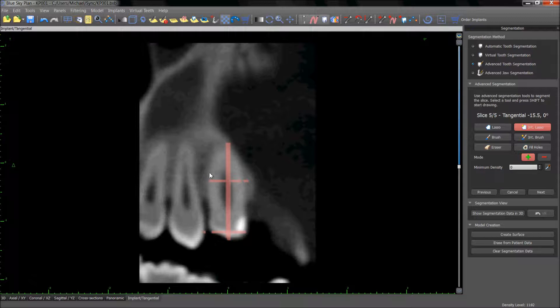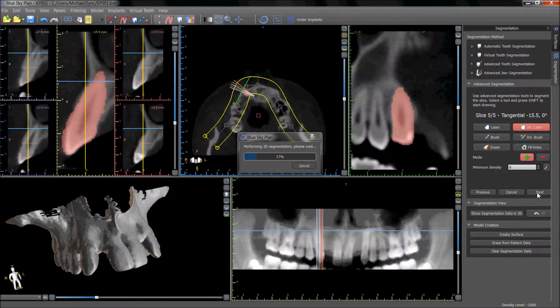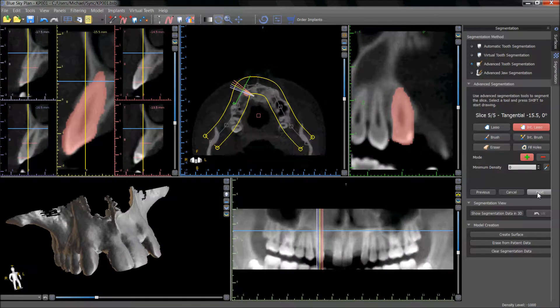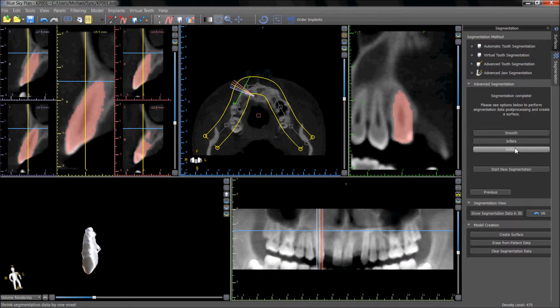The pink lines shown in the 2D views indicate the areas that have been indicated by the user. After completing the relevant slices, the software will show us the segmented tooth in the 3D view. Post processing tools such as smooth, inflate, and deflate can be used to modify the segmentation.